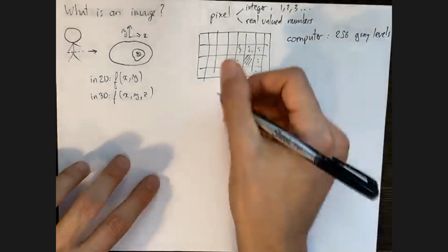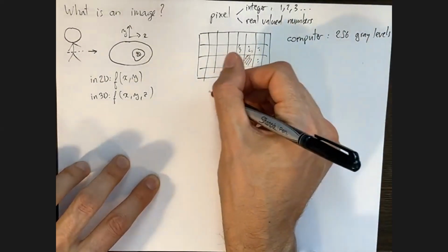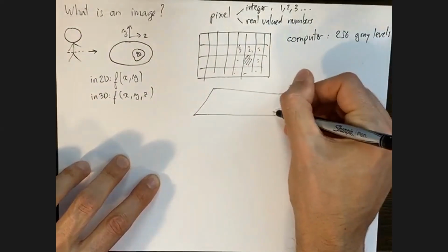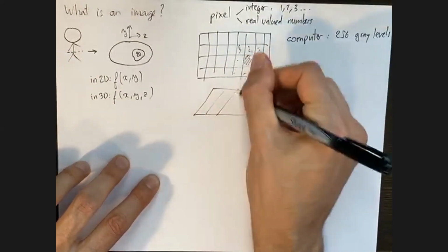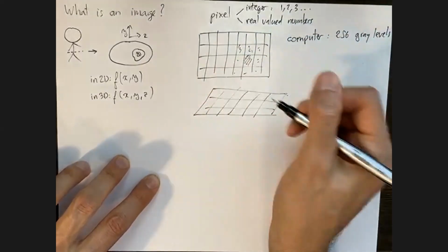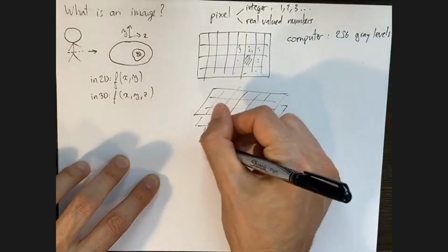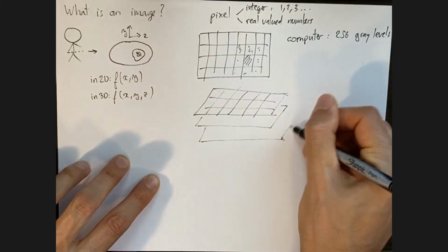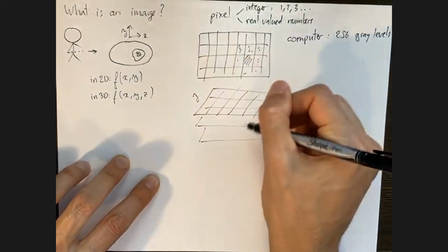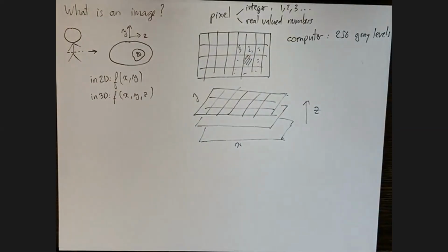And so in 3D, how do we represent a 3-dimensional distribution of radiotracer? It's going to be very simple. It's going to be a stack of these 2D images. So if we consider a stack of 2D images, such as this one, then we have a 3-dimensional distribution of the tracer now. Okay, so then the coordinates here, we have y that's here, x that's here, and then z, which is shown here.